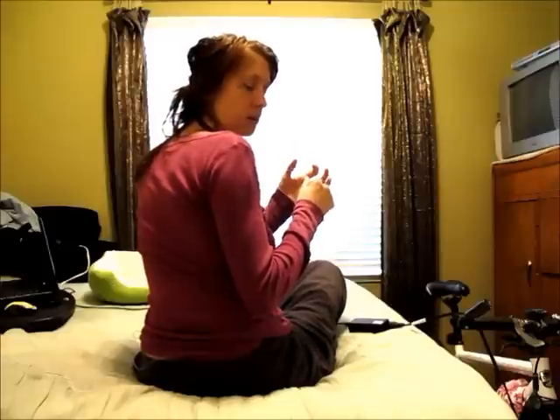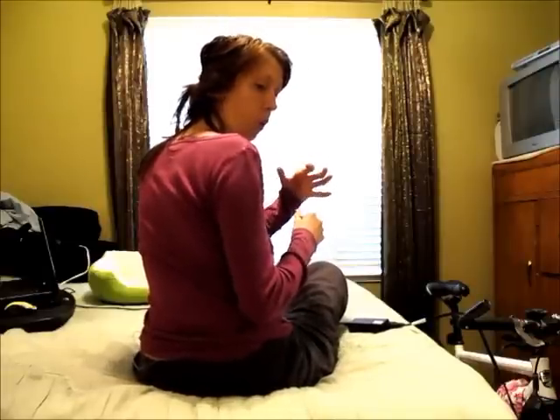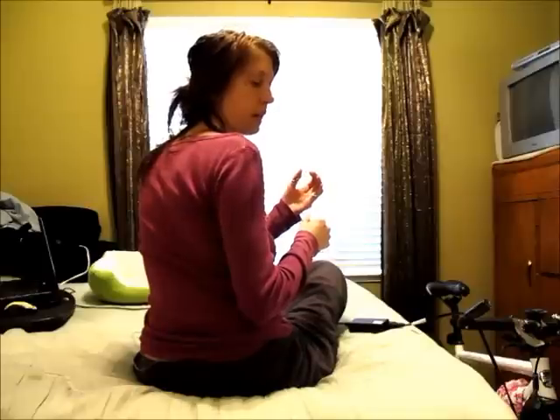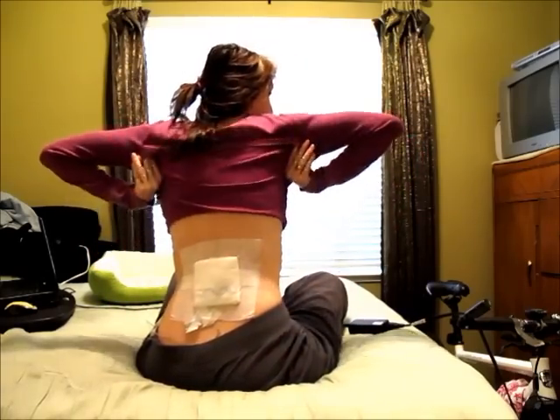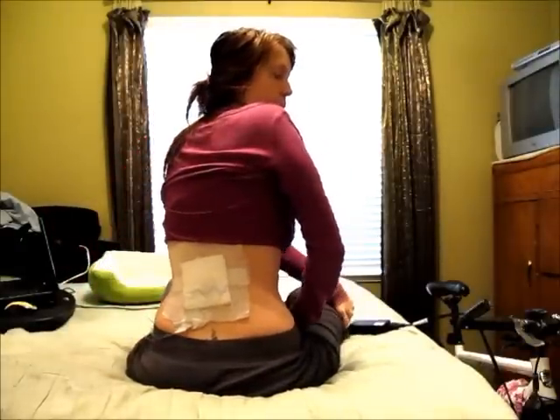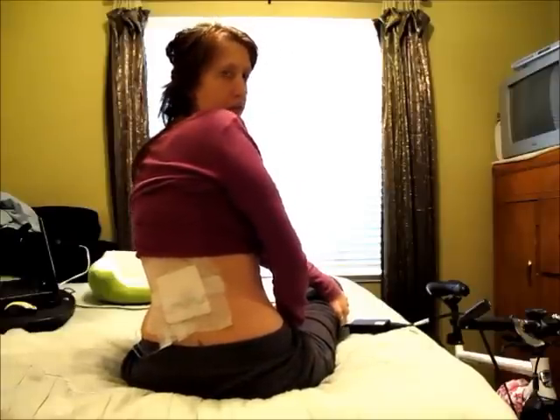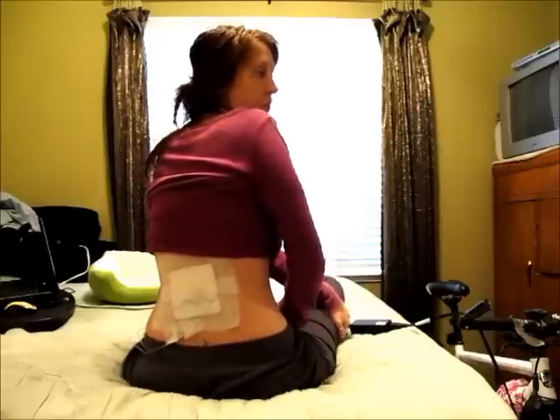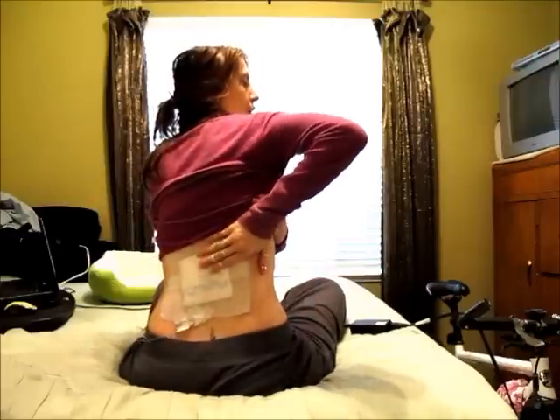And then they kind of maneuver the leads around in your spinal cord area. It's in your epidural area, just in an open space. And they try and get them to a point where they will stimulate the exact area that you're having pain. The area that I have pain, which I've shown you on the blog, is a really strange area for pain. It's not something that they normally will typically treat with a spinal cord stimulator, but because we were at the last option, or so we perceived as the last option, that's what we went for. My area of pain wraps around from about here all the way around to here and up.